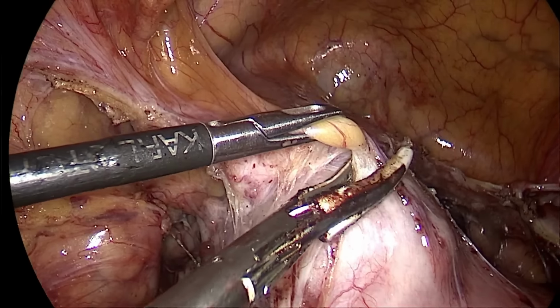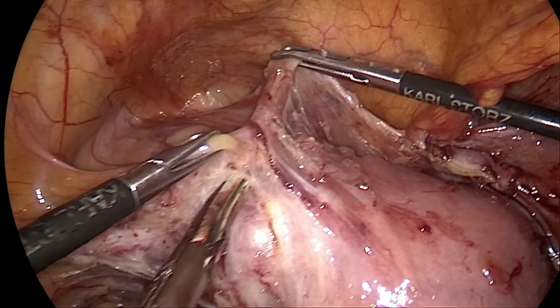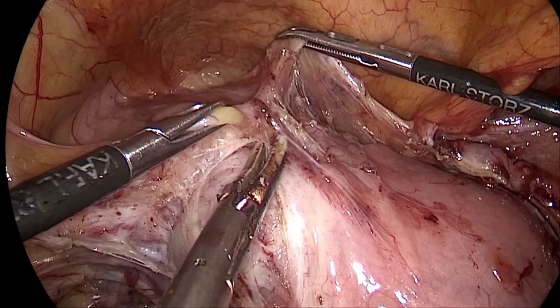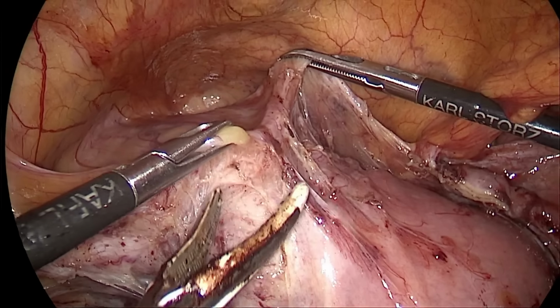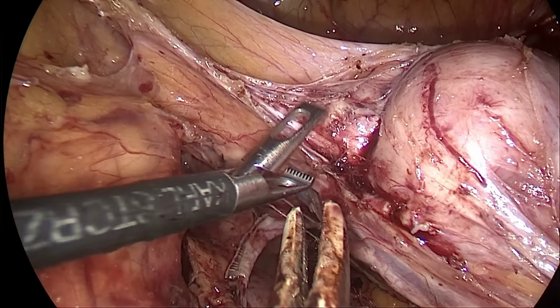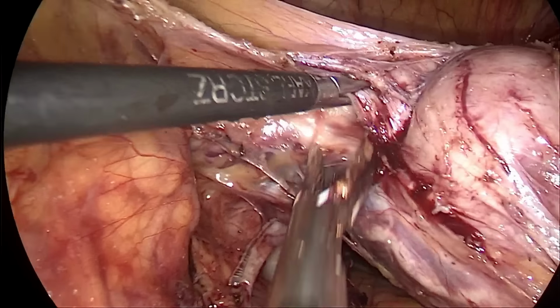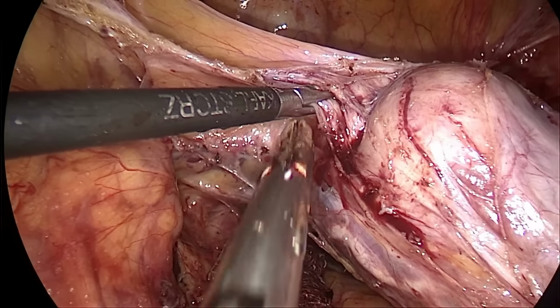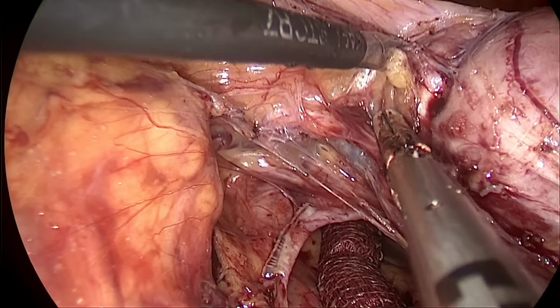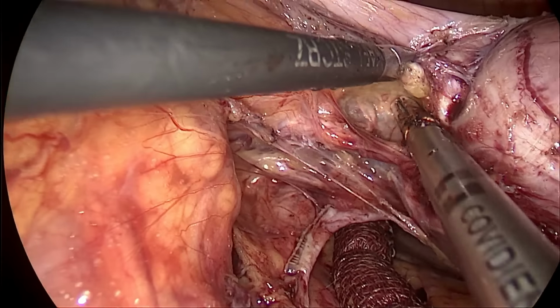So with bit by bit dissection, I'm trying to skeletonize the bladder from the uterus, which is very much adherent here due to previous cesarean section. So now I'm trying to create a lateral window if possible. Sometimes when the bladder is adherent anteriorly, we try to create a lateral window.